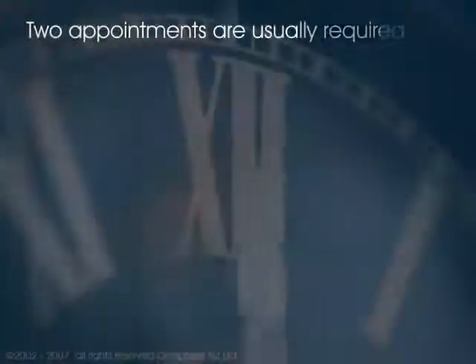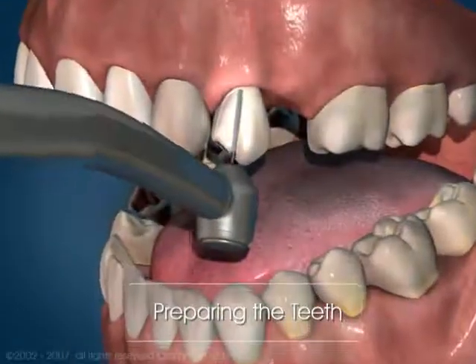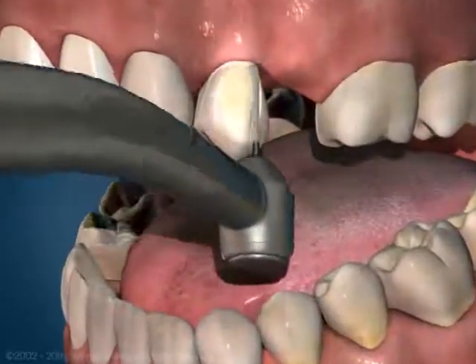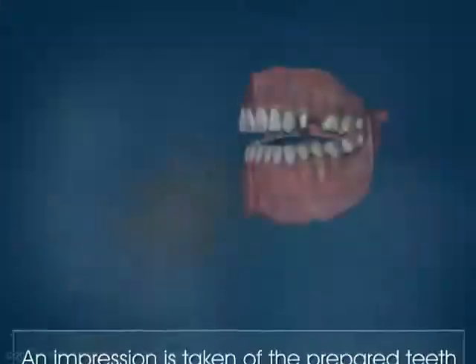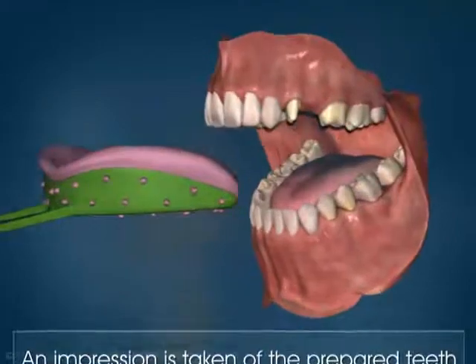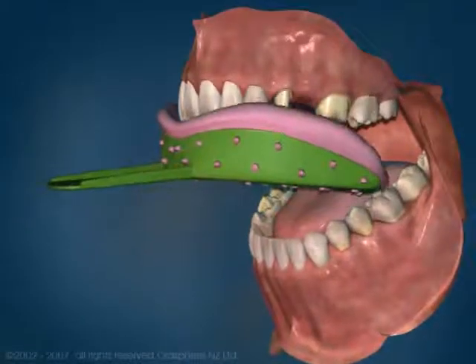Two appointments are usually required. At the first appointment, the teeth on either side of the space are prepared or shaped. An impression is taken of the prepared teeth. A temporary bridge is then placed, ending the first appointment.